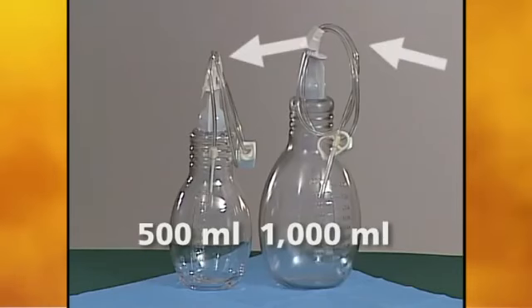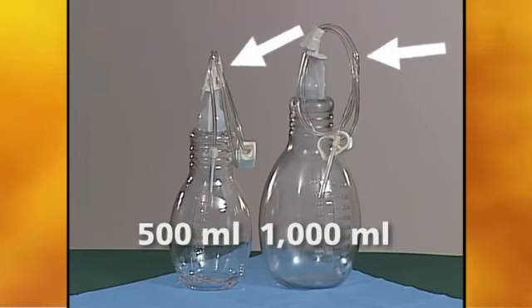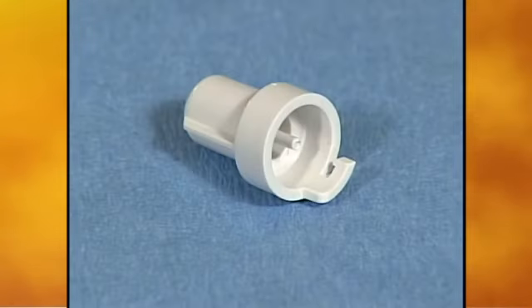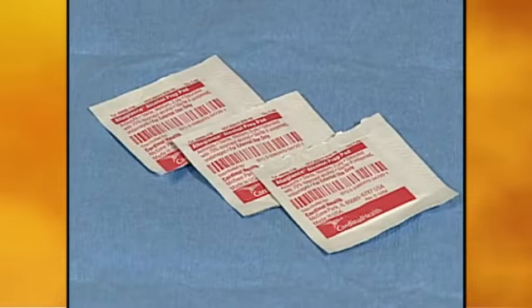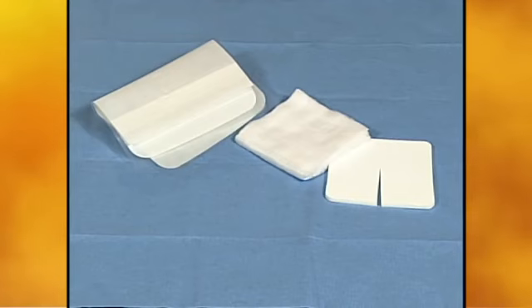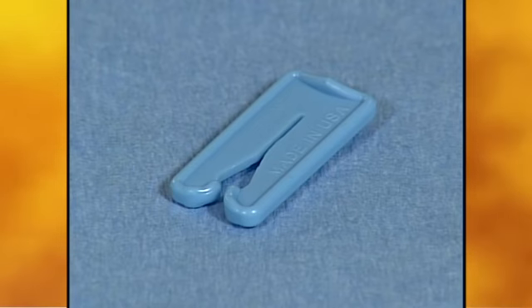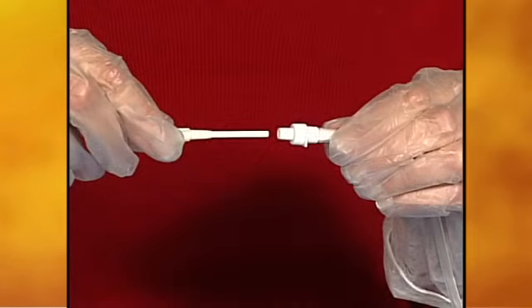The drainage bottle has a drainage line attached and will provide the suction required for drainage. Gloves, a new valve cap for the catheter, alcohol pads, and a clean dressing are included in the kit. There is also an emergency blue slide clamp which should only be used if the catheter is cut, damaged, or leaking. The drainage kit is easy to use.